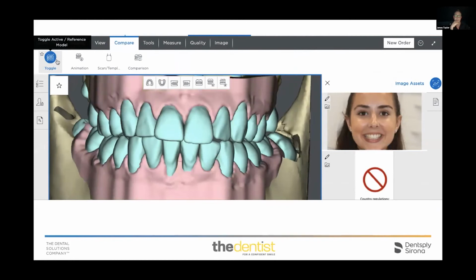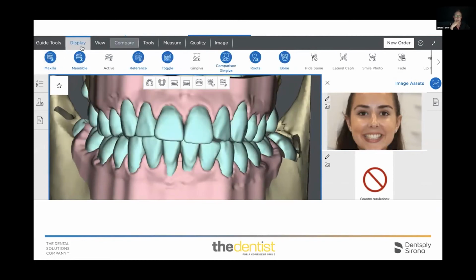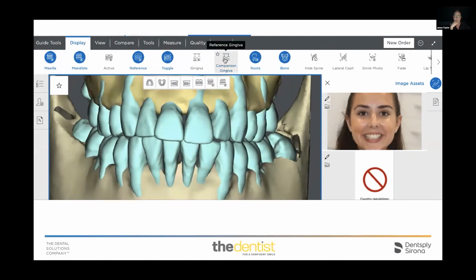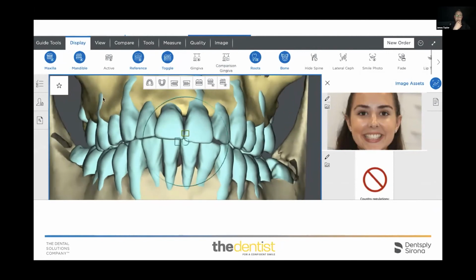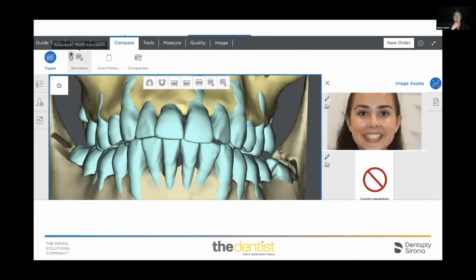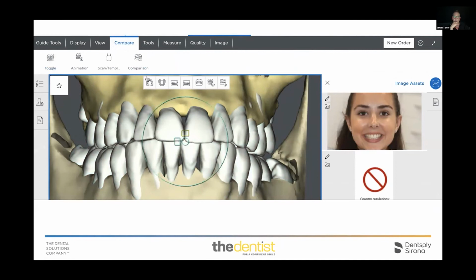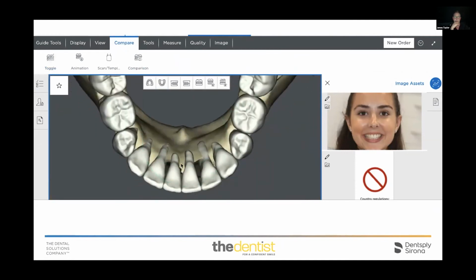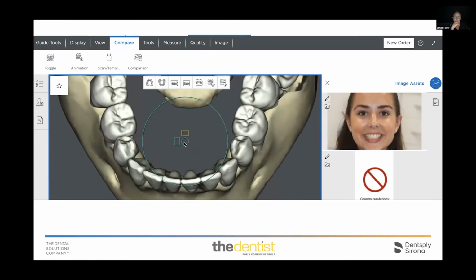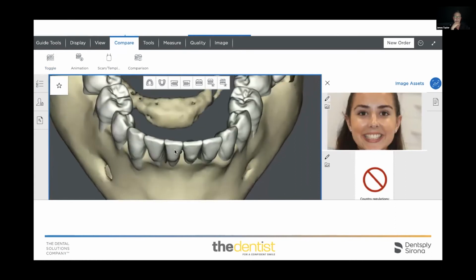We're going to tip them. We're going to torque those roots into a more favorable position. And that hopefully is going to allow me to have an area around those teeth with more bone. It's going to allow me to refer her to a periodontist who will then work with me and we'll look at grafting and we'll improve that for her and hopefully prevent her losing those teeth earlier than she should.